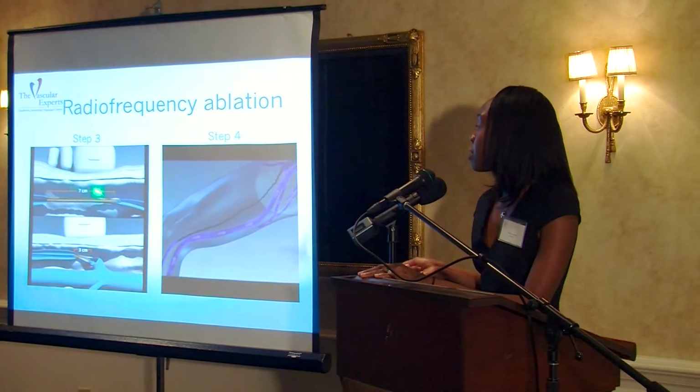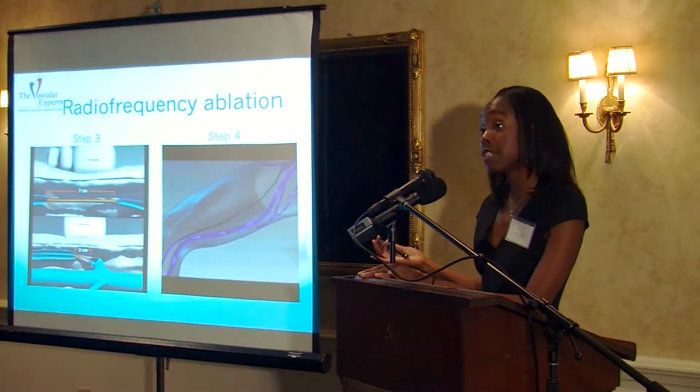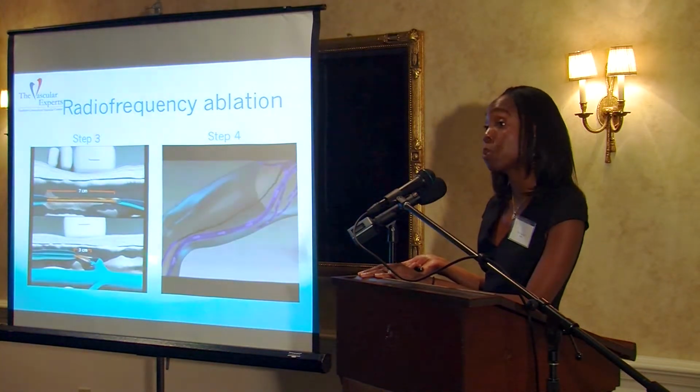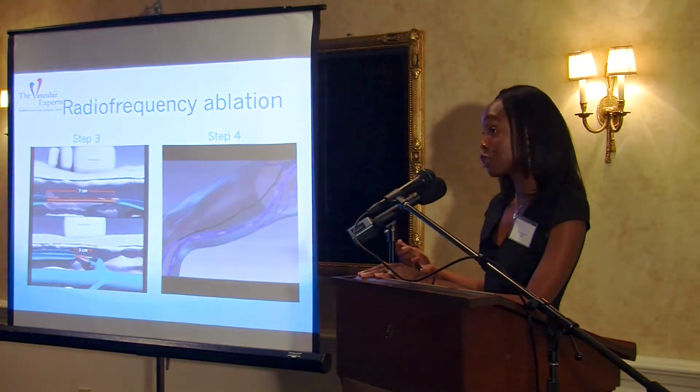The third step is the actual treatment. This is where the radiofrequency ablation actually differs from the laser therapy. The tip of the radiofrequency ablation catheter typically is 7 centimeters, so you treat a 7 centimeter segment at a time. The treatment time is about 20 seconds per segment, and then you withdraw 7 centimeters and treat the next segment. What's different in the laser therapy is that it's a constant withdrawal of the catheter, as opposed to a segment that's treated each 20 seconds or so.